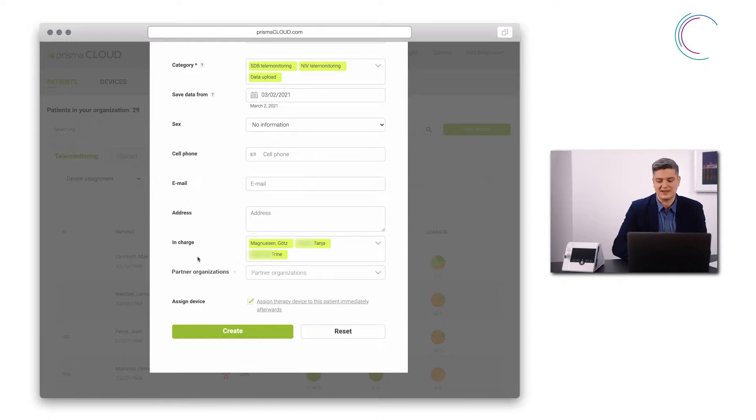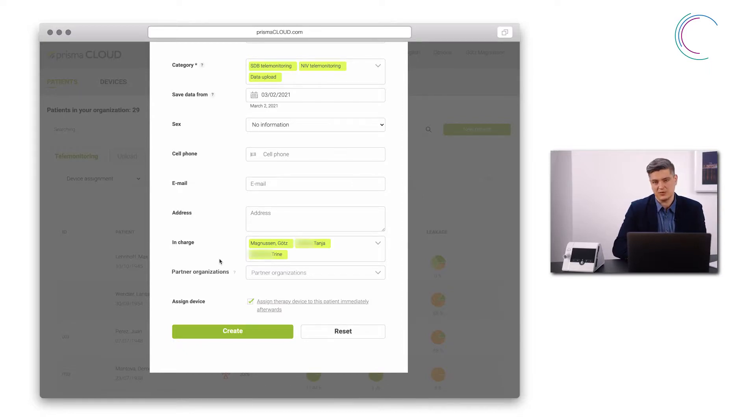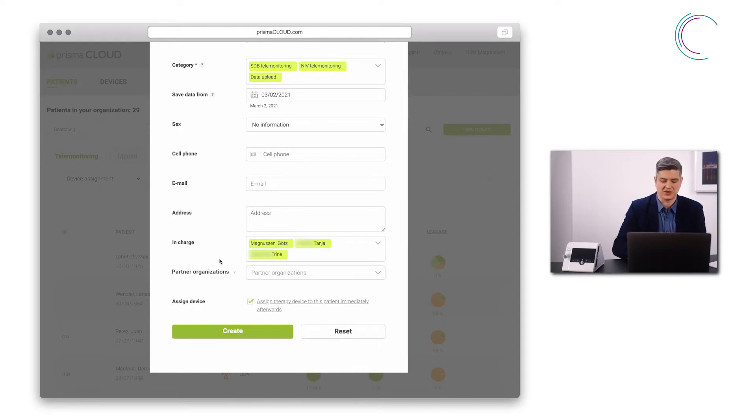Here I can define the partner organizations. This enables the option patient sharing that can then be used to share patients with those organizations.